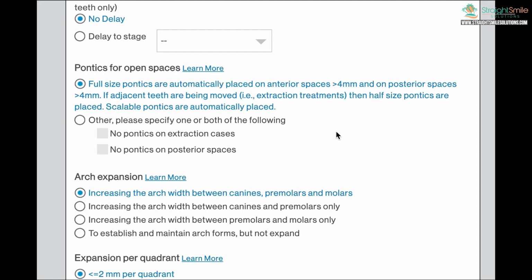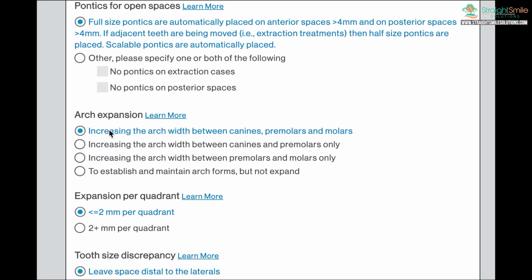I think that they also have it at the Invisalign store. You have to shade match though. And you have to light cure each individual aligner if you do that. And you have to open the bags. So it's a little gross. So, I mean, I would ask the patients first because sometimes they don't like it.